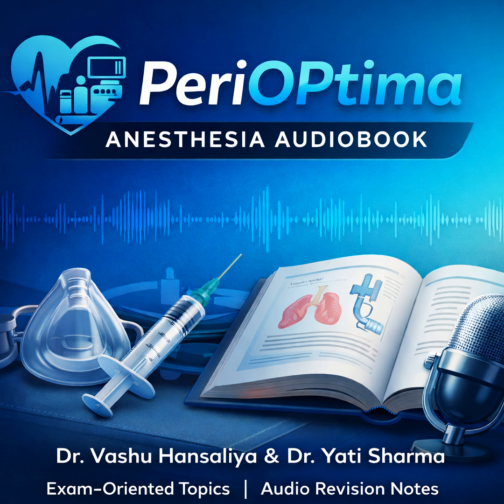Unpack that for the student who is stressed out and just needs to understand the core idea. It's simpler than it sounds. It basically means the device pumps against or opposite to the cardiac cycle. When the heart beats, which is systole, the device deflates and creates a vacuum. When the heart rests, diastole, the device inflates and pumps. It works in the exact inverse of the native heart.